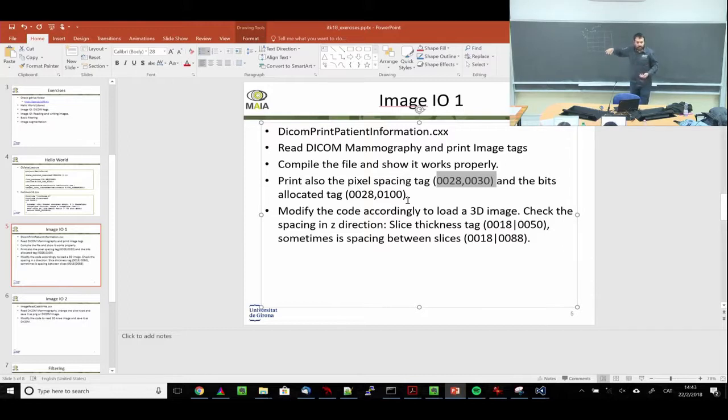Have you worked with 3D images? MRIs and all these things? Yes. Well, a 3D image is nothing more than you go and you say, okay, now I have voxels, which is a fancy name to call a 3D pixel. Okay? And you have voxels. So that means you have something, because physically as well, it has a size. So it has a size now, not only in X and Y, but also in Z. True? Okay?